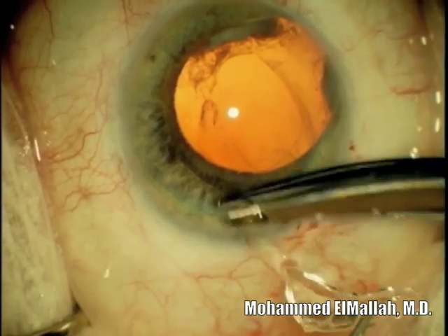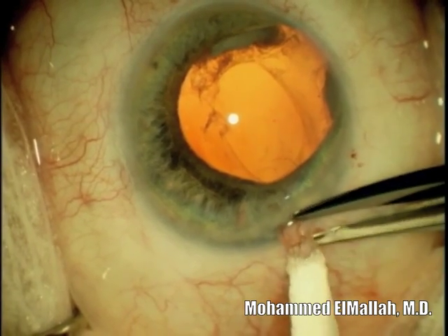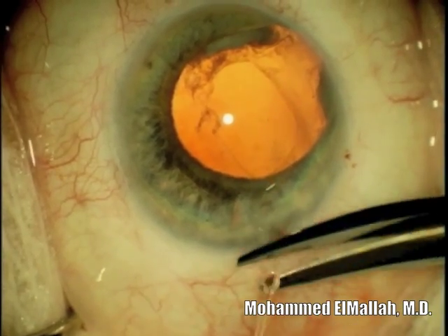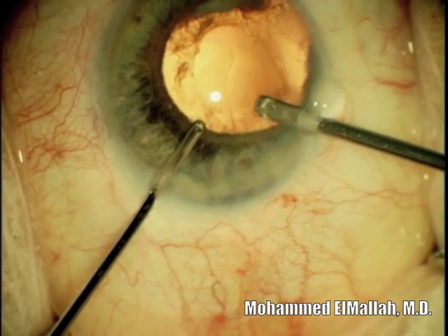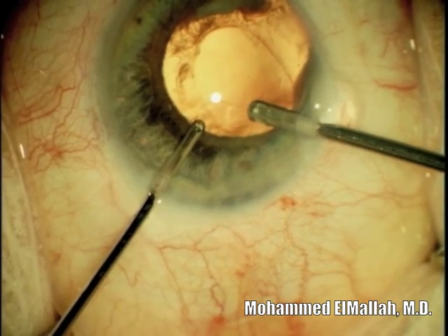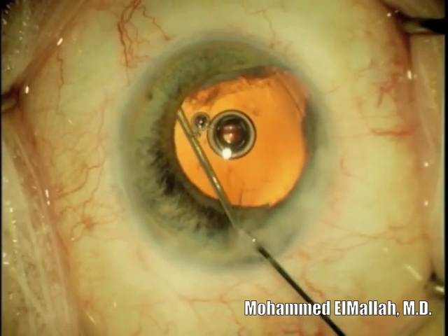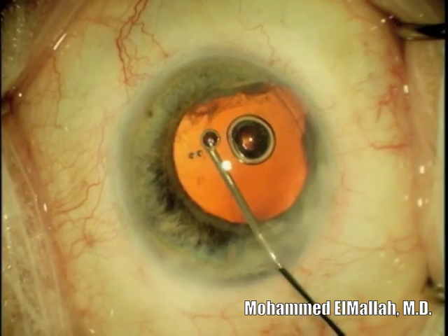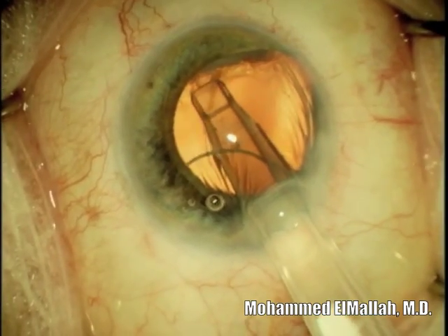As there is an opening in the posterior capsule, vitreous did present at the wound, and an anterior vitrectomy was performed. Once the anterior vitrectomy is complete, Viscoat is then injected to fill the ciliary sulcus, which will be the location of the new intraocular lens.